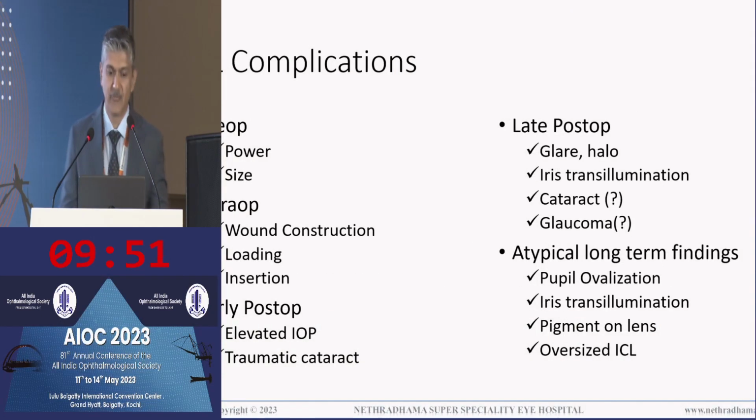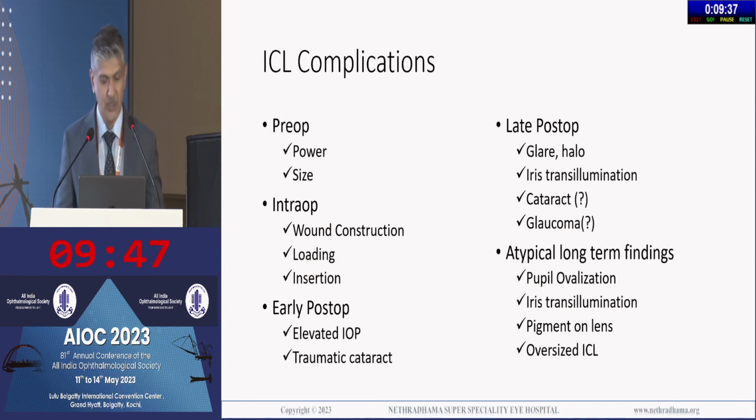If you look at ICL complications, you can have a lot of complications. Pre-op, you can have problems with the refraction power. If you don't put in the power properly, you can have post-op residual refraction. Sizing is a big issue. I think it's the biggest issue with ICLs.